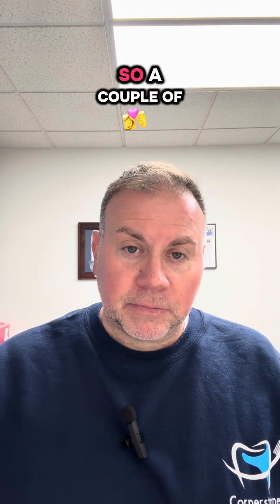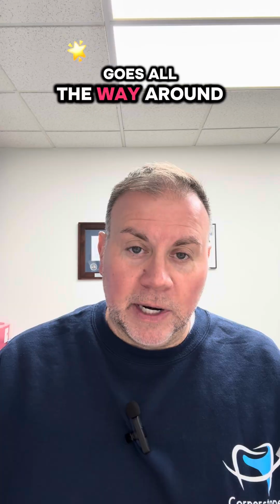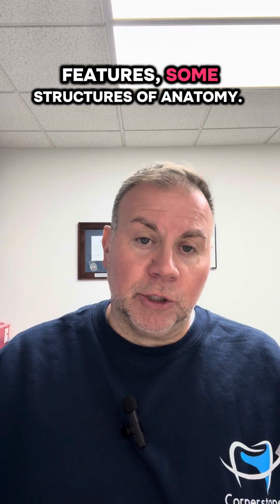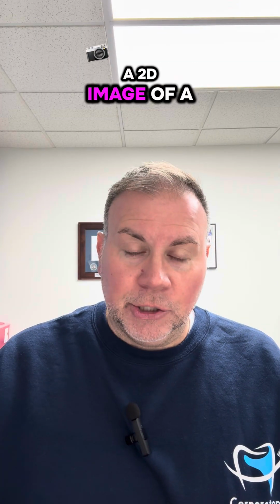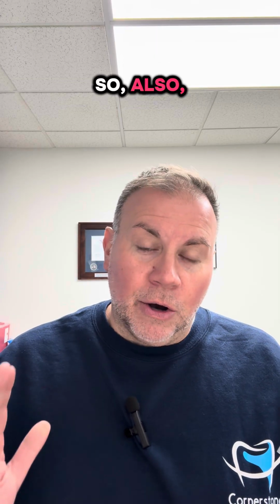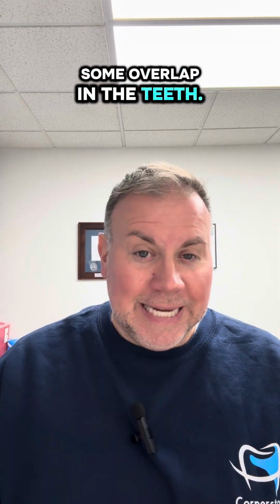There's a variety of different X-rays that they can take with you coming in as a new patient. A couple of those options might be a Panorex. The Panorex is an X-ray that goes all the way around the head, and it's going to show some important features, some structures of anatomy. But the thing about the Panorex is it is a 2D image of a 3D object, the 3D object obviously being us. So when it goes around your head, it can lead to some distortion. You might see some overlap in the teeth.